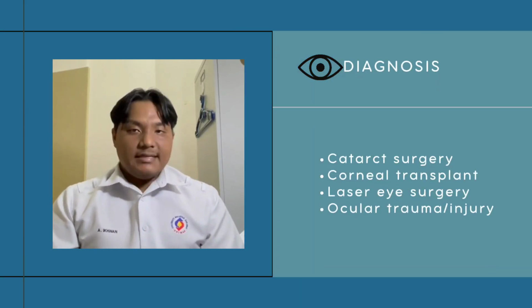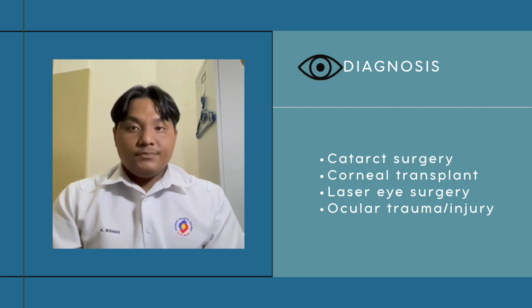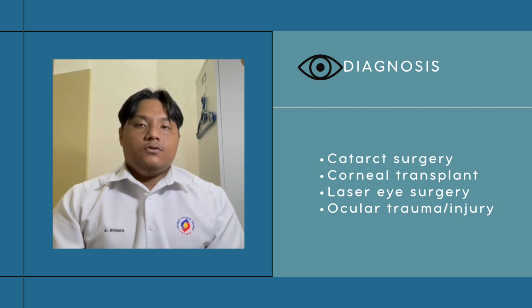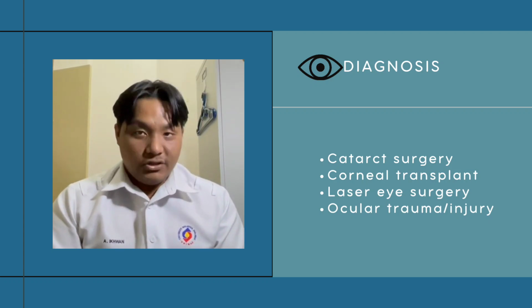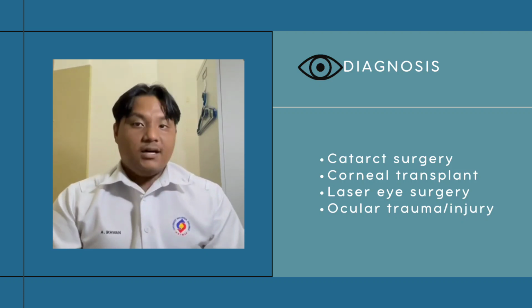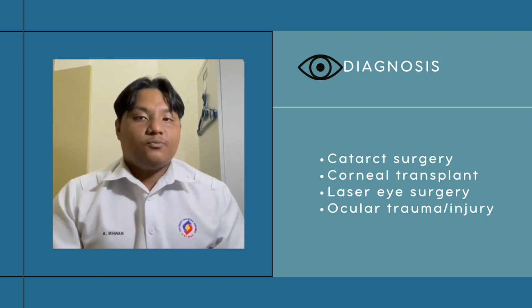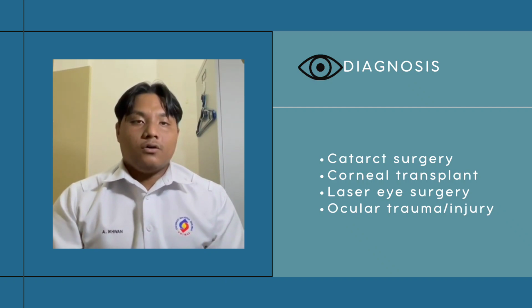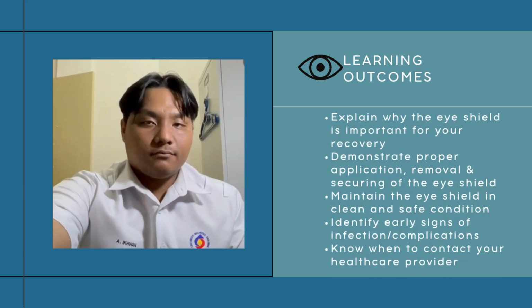So, the diagnosis for the usage of the eye shield: you may use the eye shield as part of your recovery from cataract surgery, corneal transplant, laser eye surgery or LASIK, or ocular trauma or injury. For example, a common situation in the usage of an eye shield is to protect your healing eye.